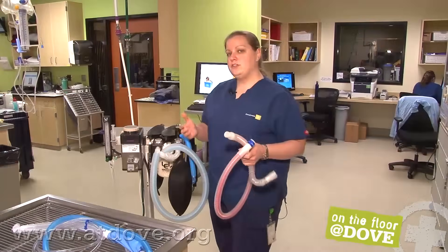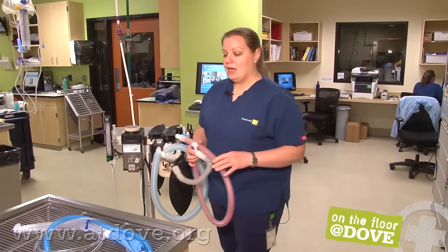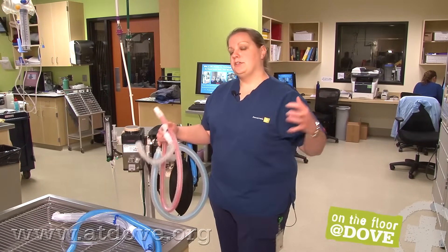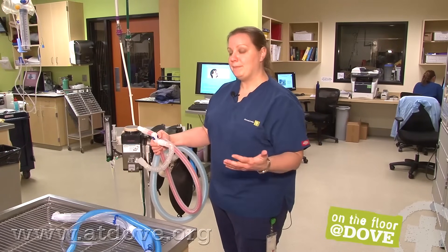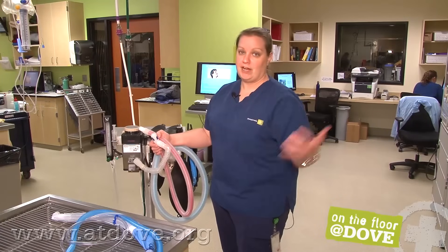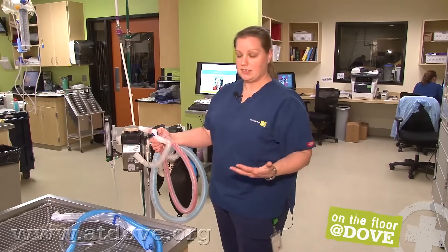The pediatric circuit is usually for patients between 5 and 15 pounds of body weight. Anytime you're going to get less than 5 pounds, you definitely want to move to a non-rebreather. Some really old or small patients, you may also want to move to a non-rebreather. What that means is that every breath the patient takes with a non-rebreathing circuit is fresh oxygen, fresh gas — they're not re-breathing anything they've previously exhaled.